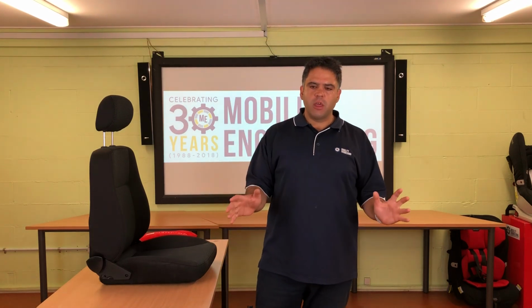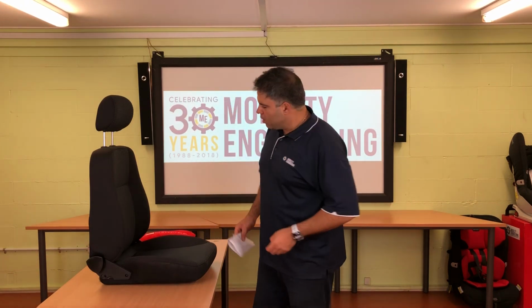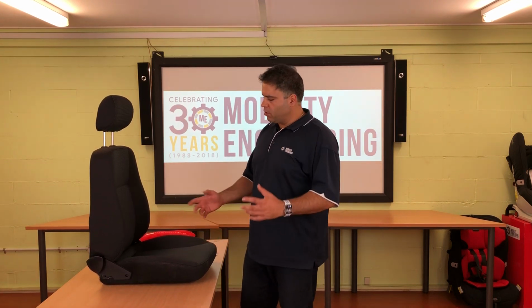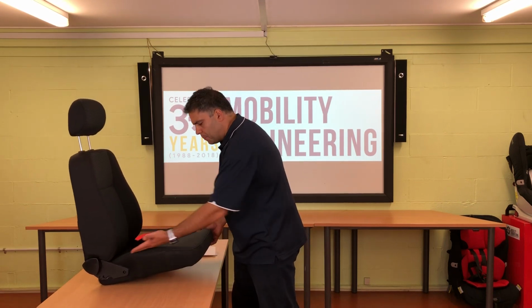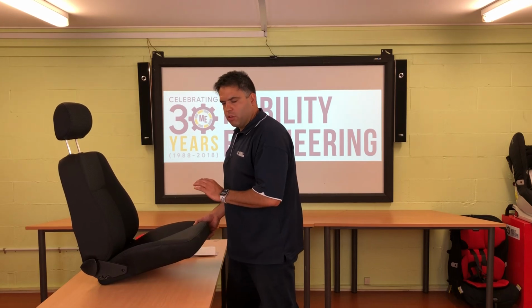We've got all that information for you today, but the first thing I'm going to do is try and explain to you what tilt in space is. So I've got a seat here, and we can pretend this is a wheelchair seat or any kind of seat, it doesn't really matter. What tilt in space means is when I tilt it, the bottom of the seat moves as well. So the whole thing moves. That is what tilt in space is.